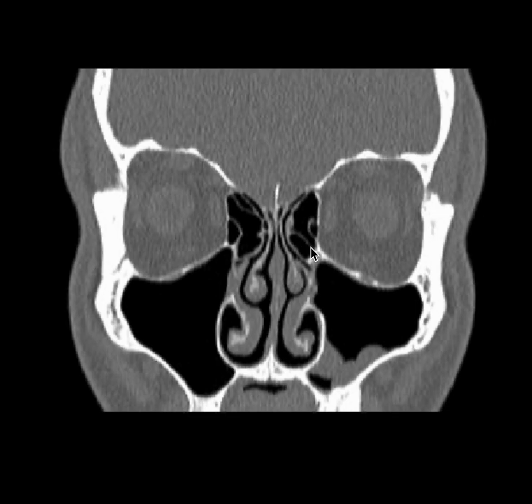These are the ethmoidal air cells. The middle turbinate on the left side is slightly smaller in size and the osteomeatal complex is congested and overcrowded.